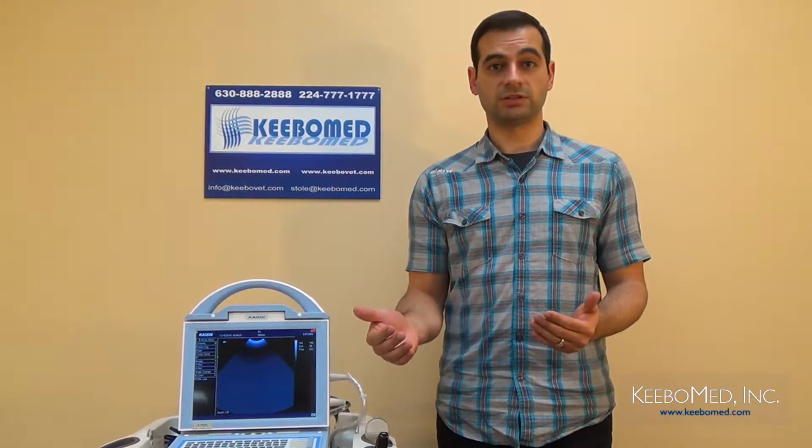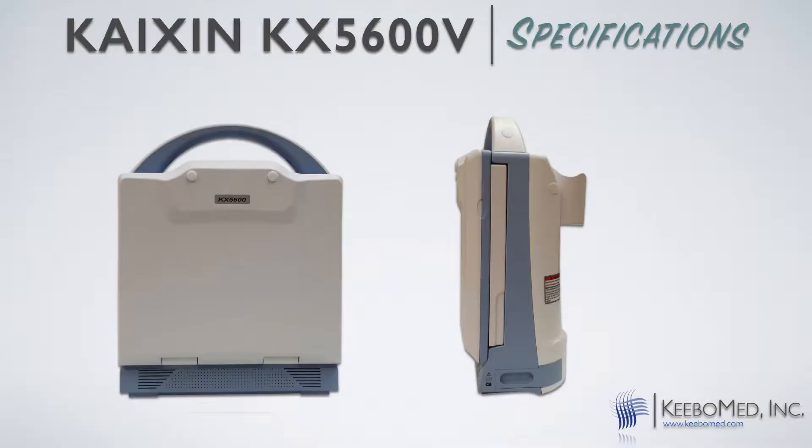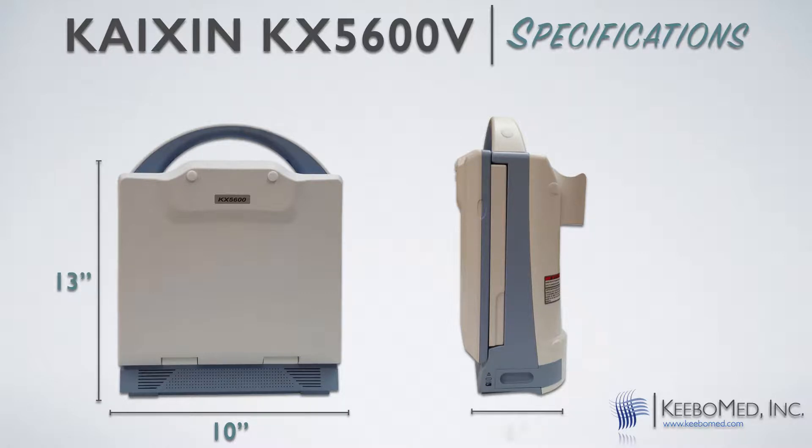First, consider the mobility of the KX5600. As a veterinarian, it is very important to be able to easily transport an ultrasound to various locations to perform exams. The KX5600 is well suited for this because it is extremely compact and lightweight. The approximate size is 10 inches in length, 13 inches in height, and 6 inches in width, and it only weighs 10 pounds.